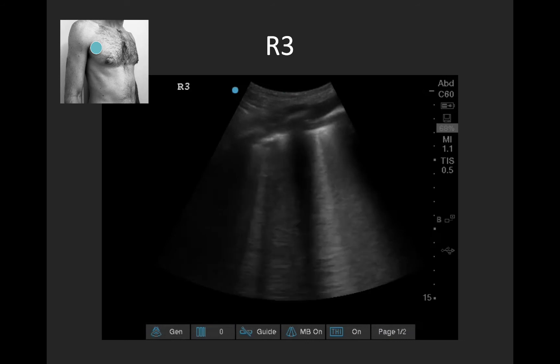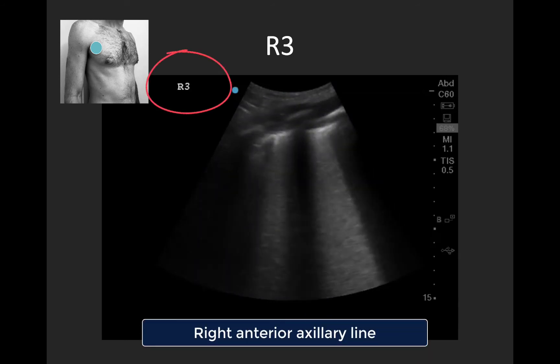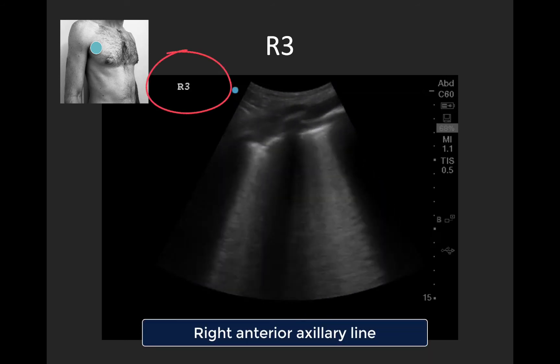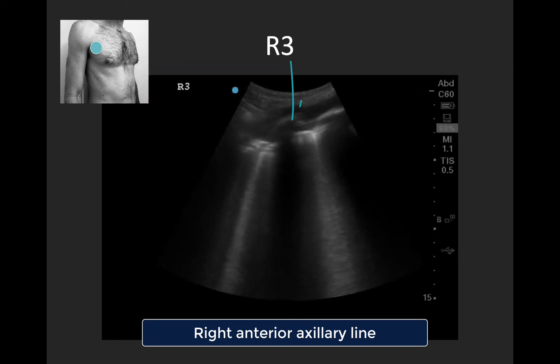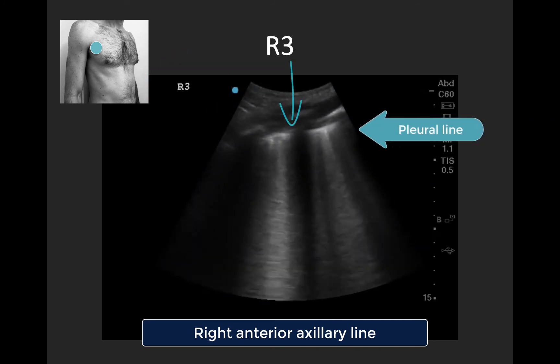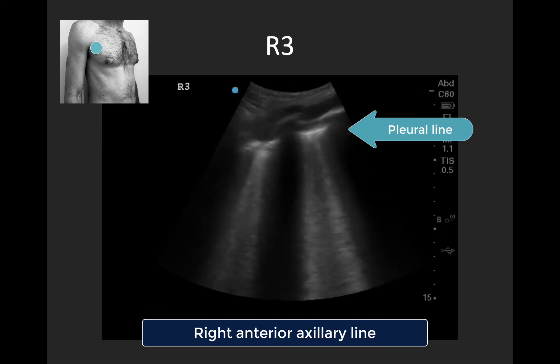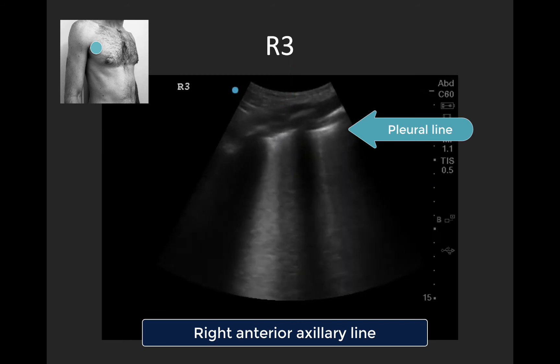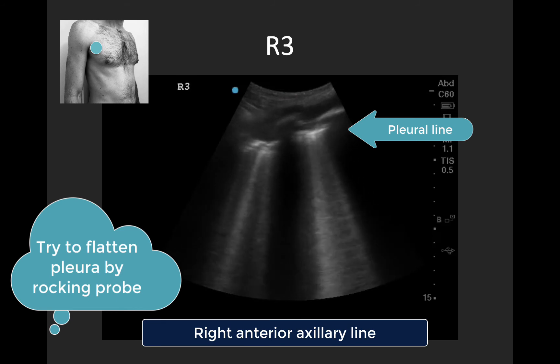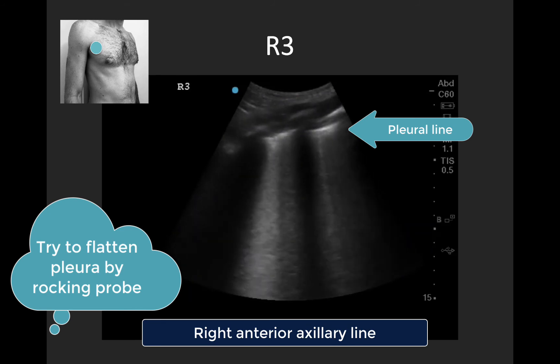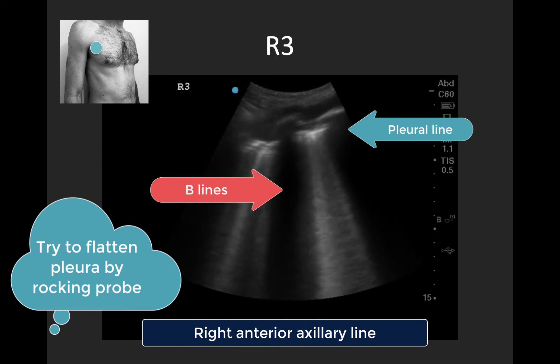Moving on to R3 — this is the anterior axillary line right up in the axilla itself. We see some soft tissue in the foreground, rib shadows, and then that bright pleural line. Note that the pleura is inclined here a bit, which can be tricky to avoid in this view, but we could try to improve this with some rocking of the probe. Again in terms of findings, we see B-lines traveling the length of our screen.